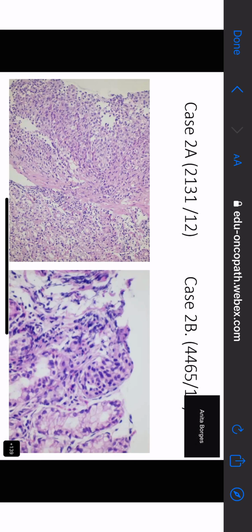What are you describing? You can annotate. Can you not? They are just cells, ma'am. Do you see any glands at all? No, ma'am. Okay. Vimi, do you see any glands on the left-hand side?